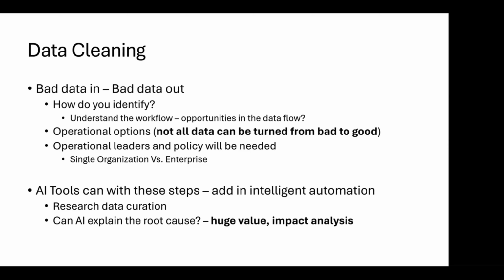It was a smaller site, had a very non-redundant PACS system, and they had a data storage problem. So the database knew of the metadata, but the actual pixel data was not restored from the full backup system restore. Fun fact about that story, that happened 8 months after I started as a PACS admin. So not a lot of time in the career to have that happen, but got through it.